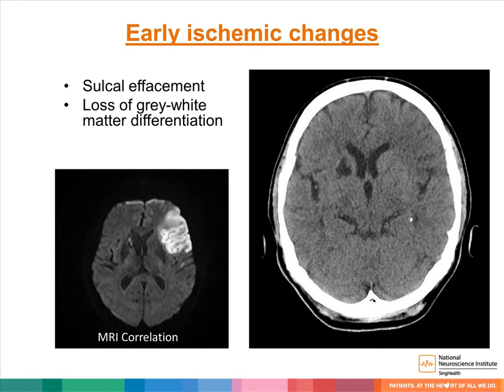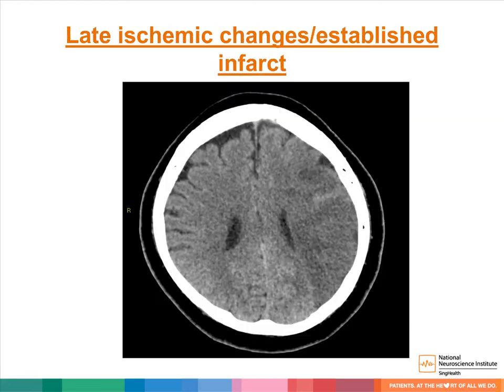Do note there is a hypodense area in the right caudate and lentiform nucleus region compatible with an old infarct as well. In this example, there is a discrete wedge-shaped hypodense area in the left cerebral hemisphere, compatible with an established infarct in the left middle cerebral artery territory.